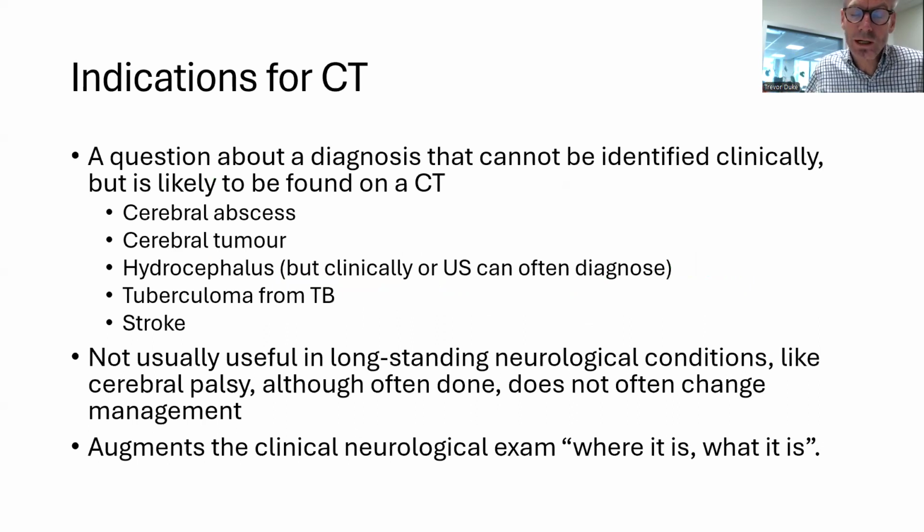CTs are becoming much more widely available now in provincial hospitals, so it's worth us knowing about that. I think, though, that when people get CT scans, they may think it somehow replaces the clinical process, but it doesn't. It really just augments the clinical process. And before you do a CT, you always need to have a question about the diagnosis that can't be answered by all the other information you have, but is likely to be found on a CT.